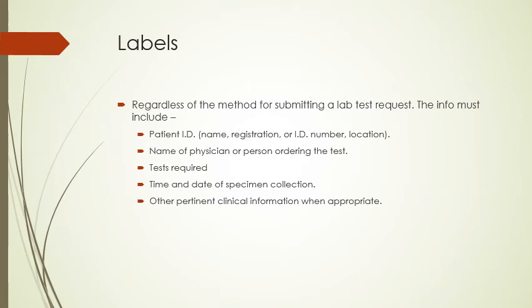The one thing that I want to add is we need to make sure we're putting the time and date of the specimen collection if it's not already on the printed labels. All right, the time and the date that we actually collected. We drew their blood. What was the time and what was the date?